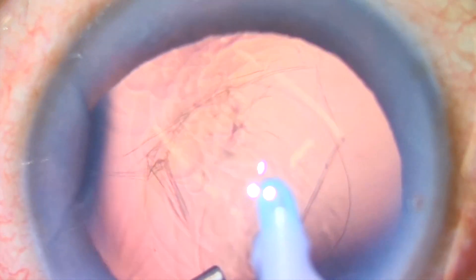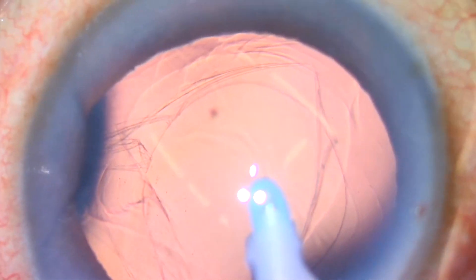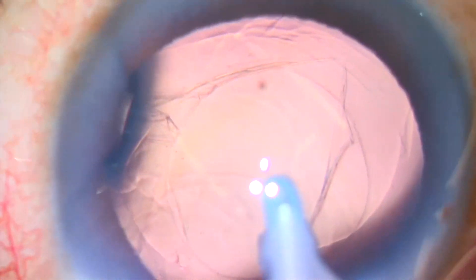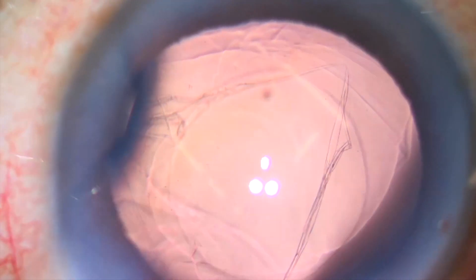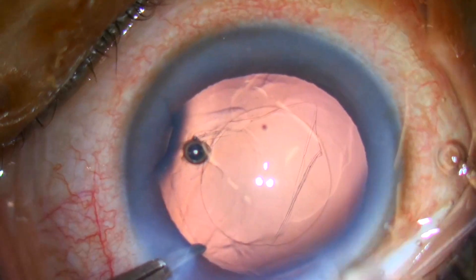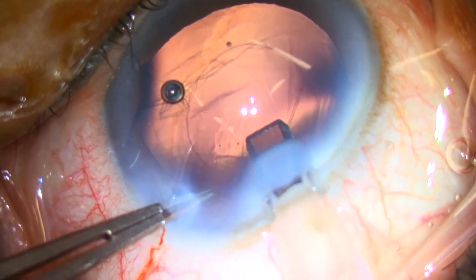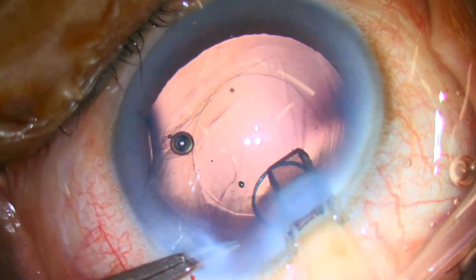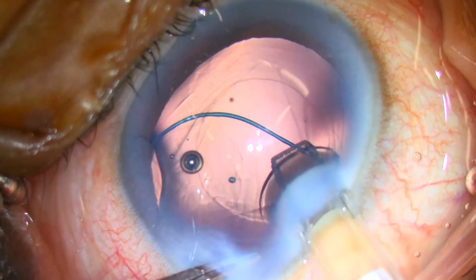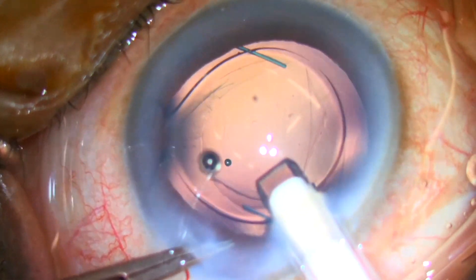Then place our Ocu-Coat viscoelastic into the capsular bag to tampon out the vitreous so it does not prolapse anterior to the posterior capsule. As we inject viscoelastic, the horseshoe capsular tear extends and becomes more stellate in shape. We then remove our irrigation and aspiration instrument from the eye. We infuse enough viscoelastic to keep the eye formed and hopefully keep the vitreous posterior to the posterior capsule or tear.